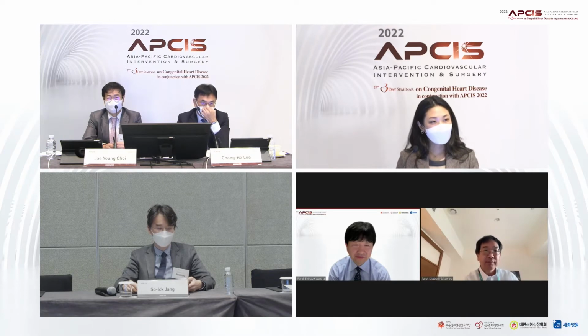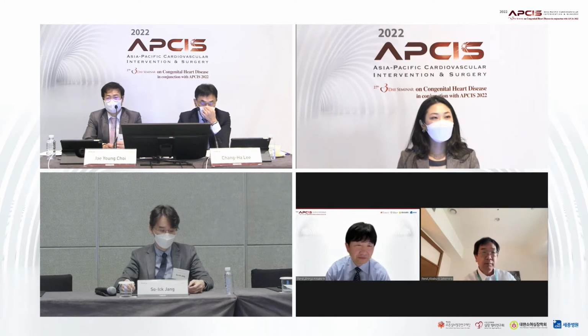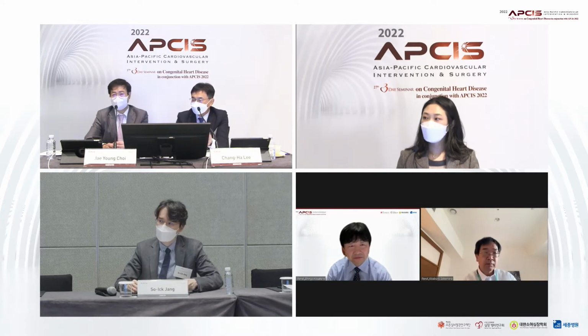So it can almost double the size of the stent, with the stent spreading, and then we do the patch angioplasty. That's what we usually do. If you want to extract the stent, it can damage all the endothelium, so it can be a big problem. So that's what we usually have done.